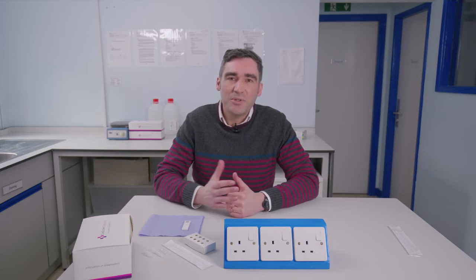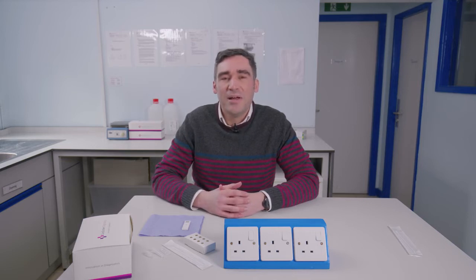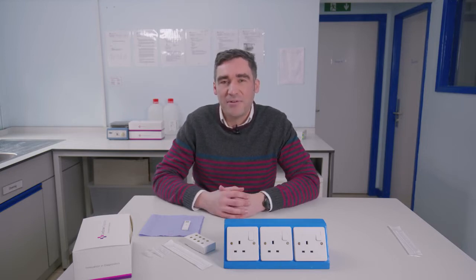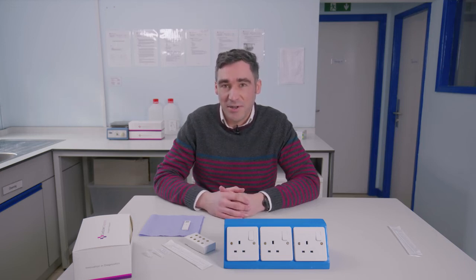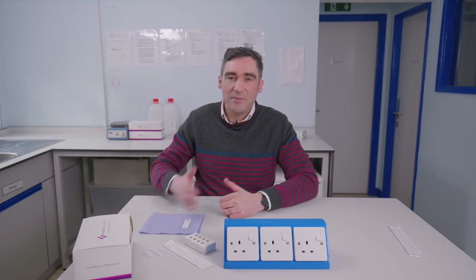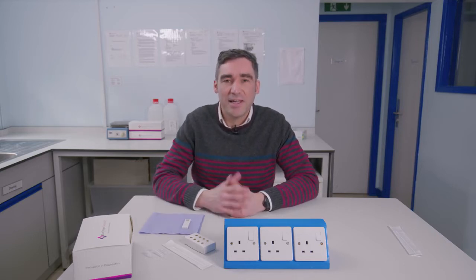When it comes to collection, we want the collector to be wearing PPE gear so that there's some protection from any antigen positive person. Also it's a good idea to make sure that you're fully aware of the information in the product insert as well. I'll introduce Alice and she'll come on and take a sample.